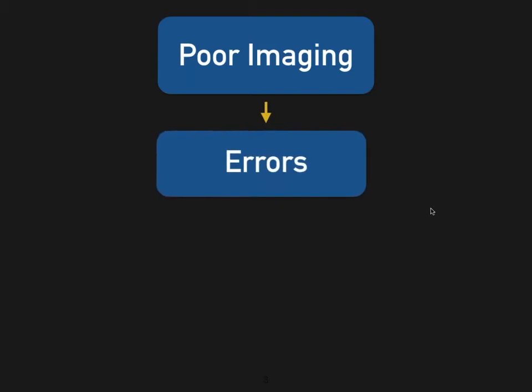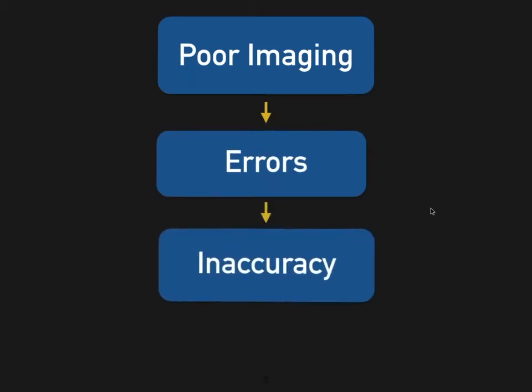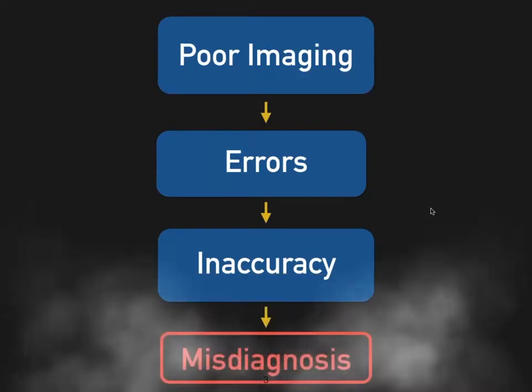As a sonographer and imaging specialist, optimization plays a big role in producing quality imaging, especially when evaluating the heart. So here are just a few tips and pearls that may be helpful for you and that you can apply to your practice. Poor imaging, as we all know, leads to many errors, study inaccuracy, and eventually a big misdiagnosis.